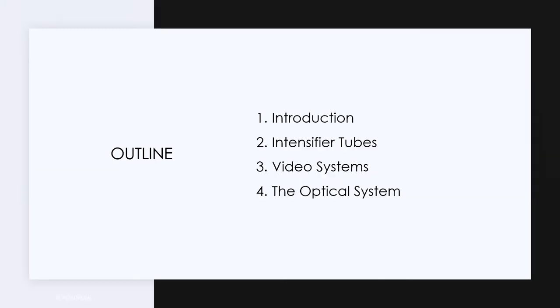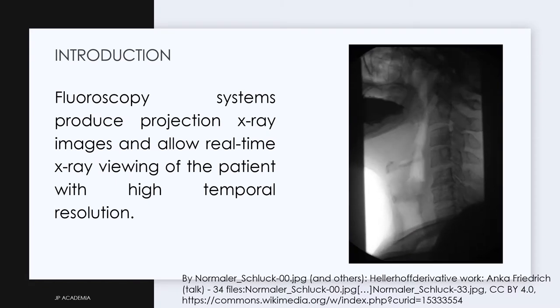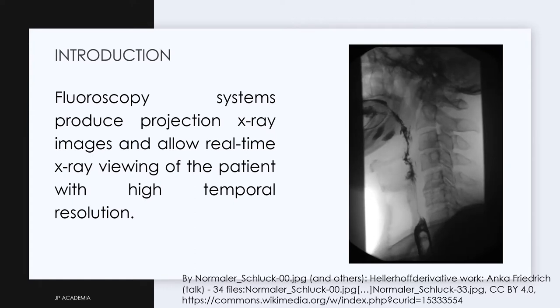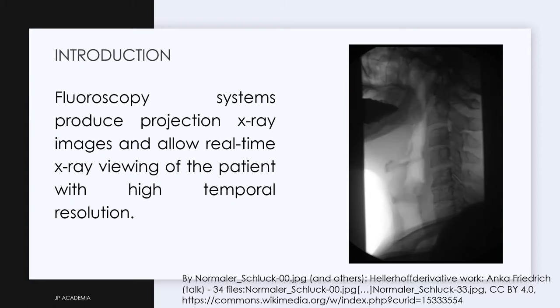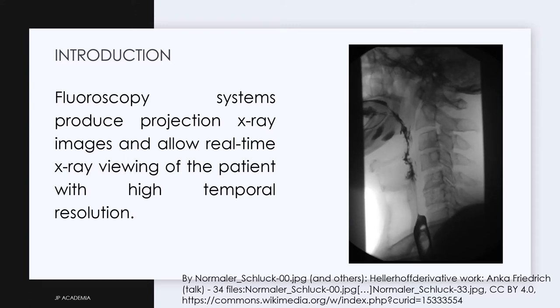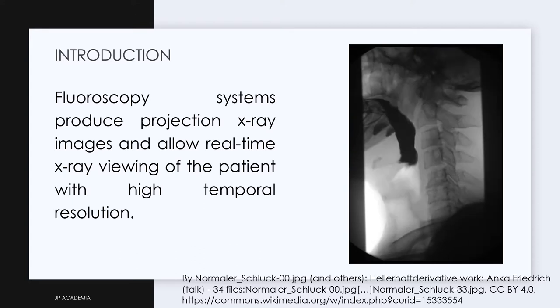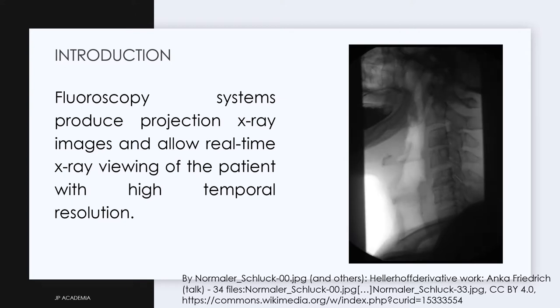Let's start. This is the outline of this video lecture. Okay, now let's start by answering the question, what is fluoroscopy or fluoroscopy systems? Fluoroscopy systems produce projection X-ray images and allow real-time X-ray viewing of the patient with high temporal resolution. They are commonly used to position the imaging system for the recording of images that includes angiography and to provide imaging guidance for interventional procedures such as angioplasty.